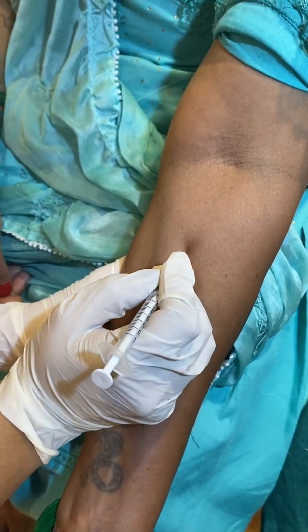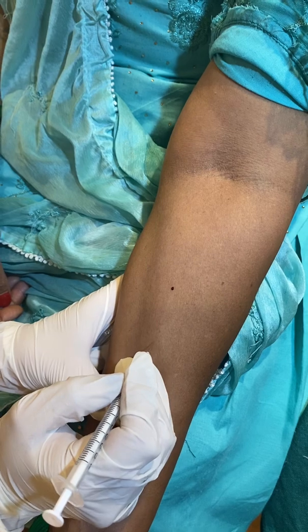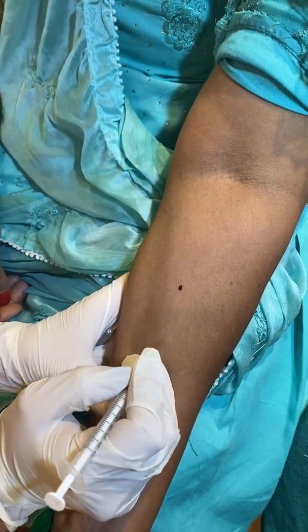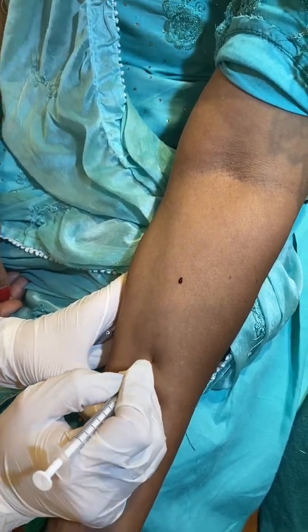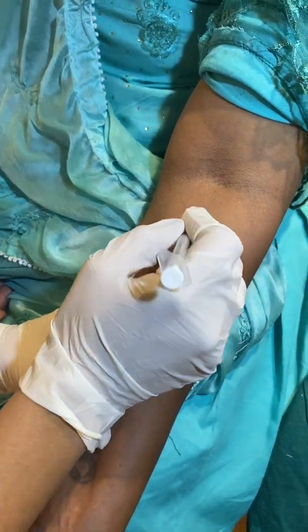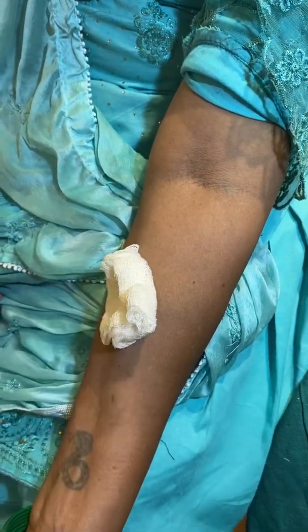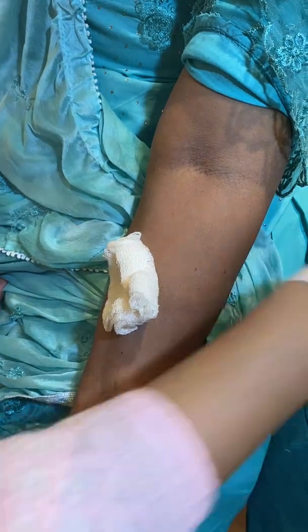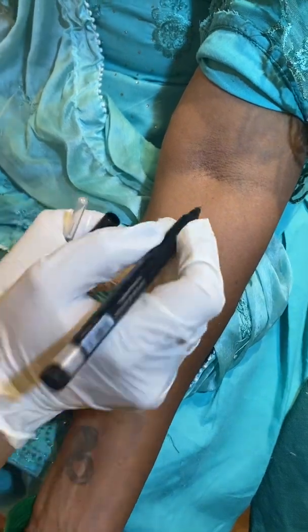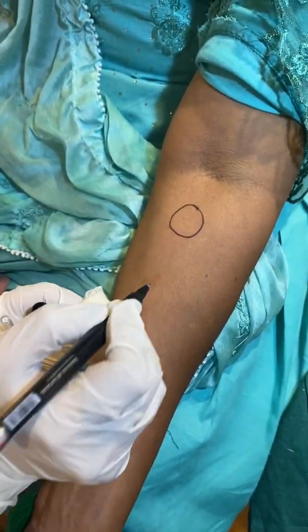We are on the ventral aspect of the forearm and we are going to perform the pathergy test here. We have already told the patient about what we are about to do. We are going to make multiple pricks — we have already made 3, 4, and 1 over 5. Make sure that you mark a boundary around the pricks so that you know where to expect a response.